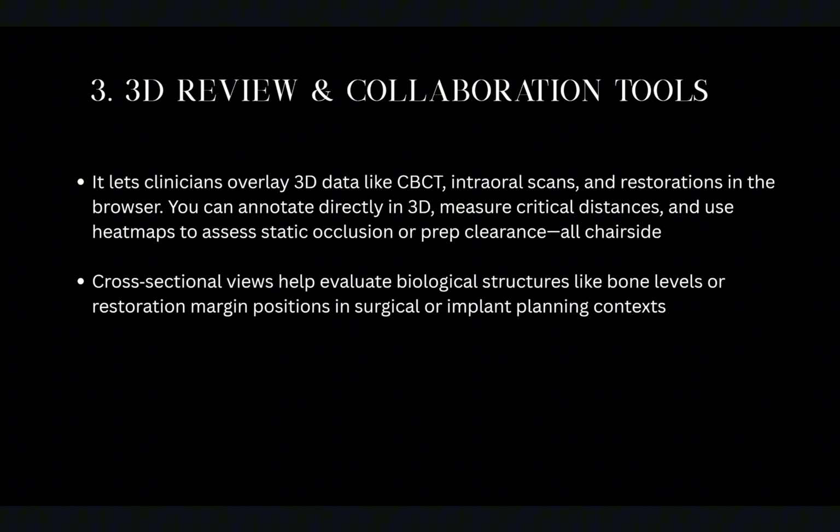The cross-sectional views also help you evaluate biological structures like bone levels or restoration margins and positions, particularly in surgical implant planning contexts. Yes, you could do this on other softwares, but it's simple, it's easy, everything's already loaded. You just have to select what you want to build into the stack.